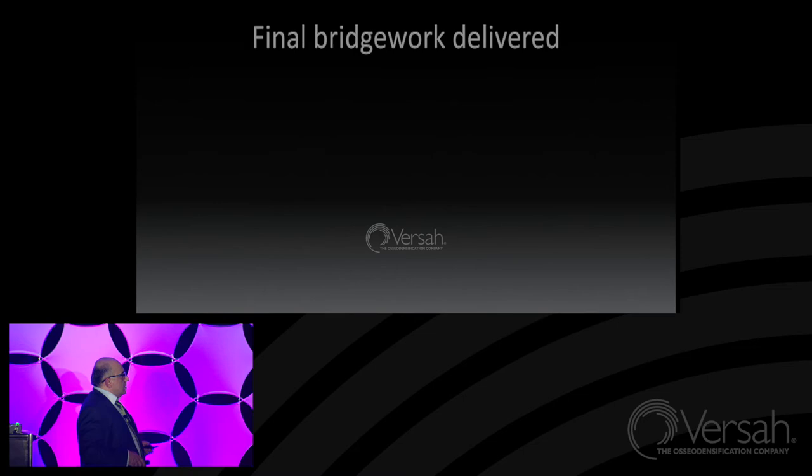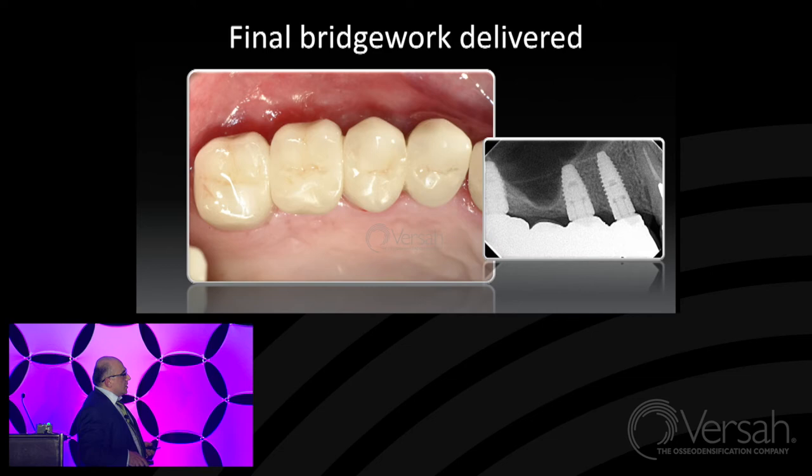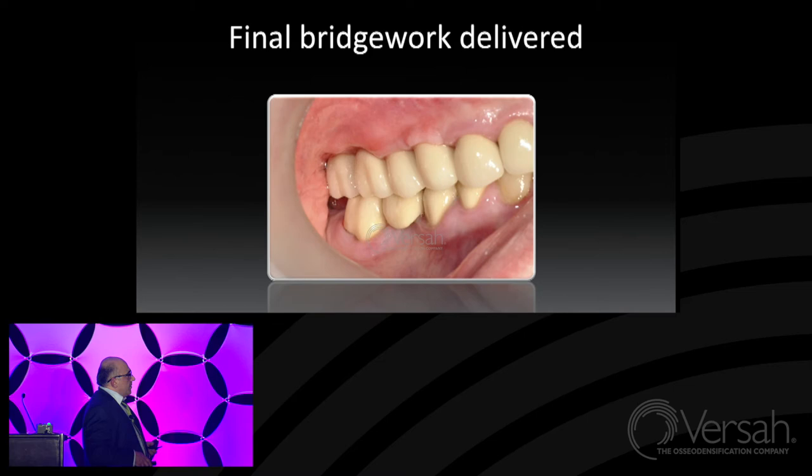This is the day of delivery of the bridge. This is the occlusal view, control X-ray, to be sure that there is no cement remnants around the implant. And this is the final view of the bridge work we delivered at the end of this work.